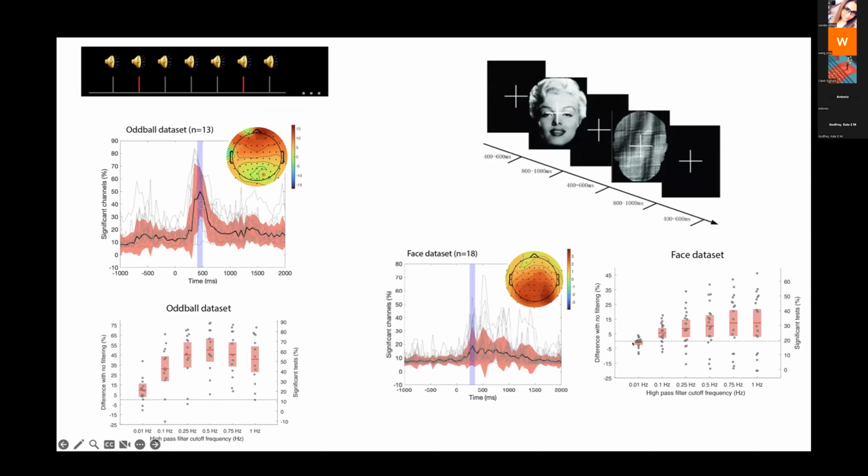This is recorded in MEG. This is a Neuromag. So even though this is EEG, this is EEG recorded in Neuromag, and this amplifier actually does high-pass filter at 0.1 hertz, the amplifier itself. So this might be why there's a difference between these results and these results.